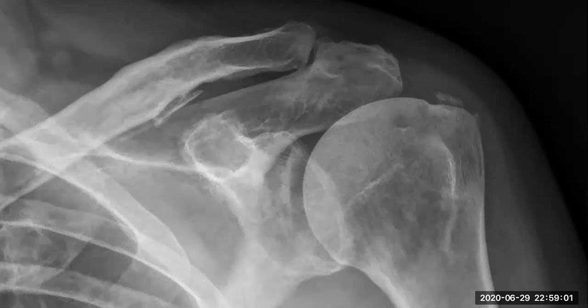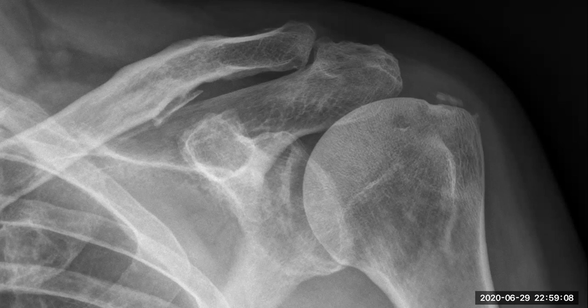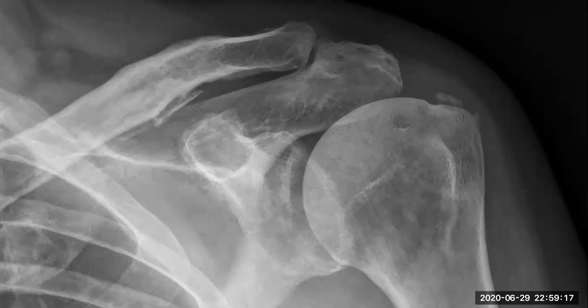This is sometimes hypertrophied and will narrow that space. As we said, acromioclavicular OA changes and also calcific tendinitis. What is the type of calcification here, the crystal? Hydroxyapatite deposition. Hydroxyapatite crystal deposition. Okay, very good.